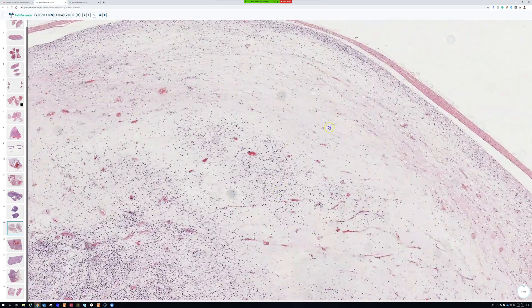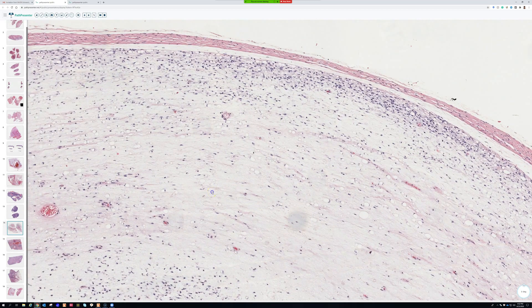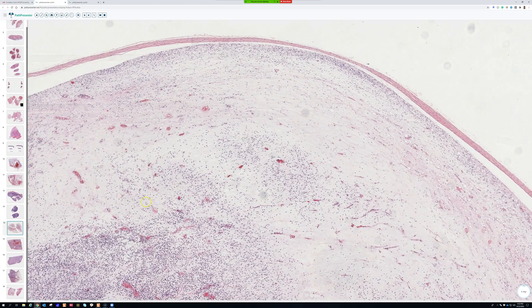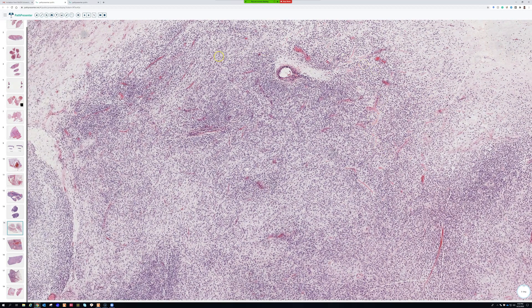It can be hard to tell how much is enough to call it round cell. At the periphery of lobules in myxoid liposarcoma, cellularity tends to increase — this is totally normal to see at the edges of lobules. What I learned in fellowship from Dr. Weiss is: if I thought it could be round cell, the answer was probably no — it's probably not enough. So in general, back down if there's any doubt.